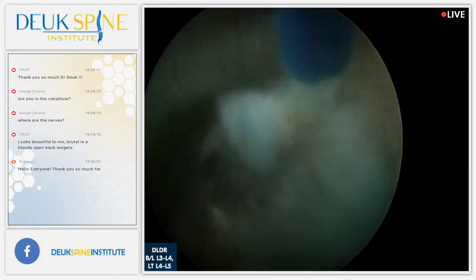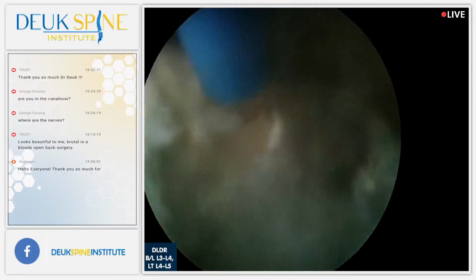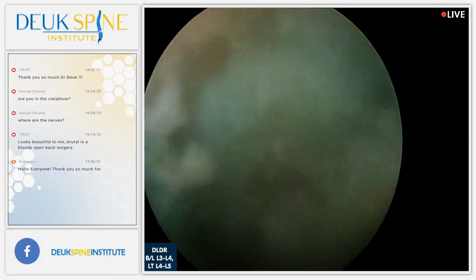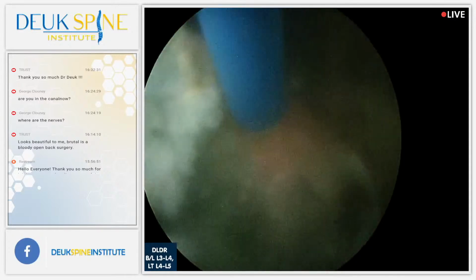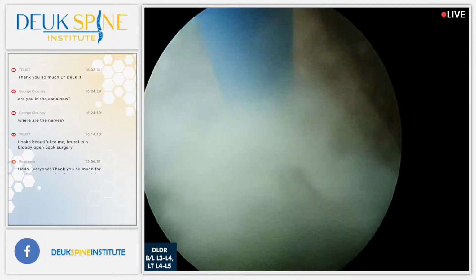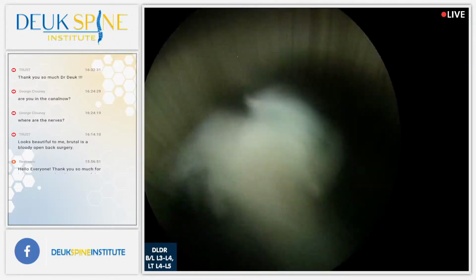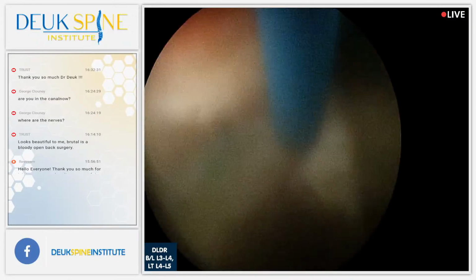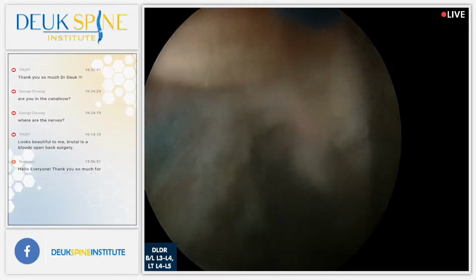You can turn that off. Yeah, it's right on my eye. Thanks. Boy, look at all that calcium. More herniation. There it is, 5 minutes.